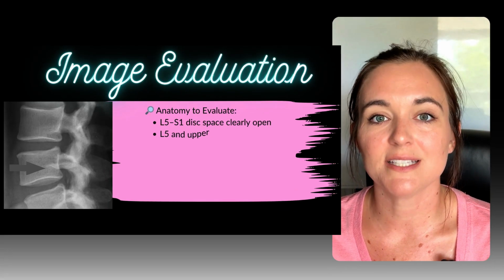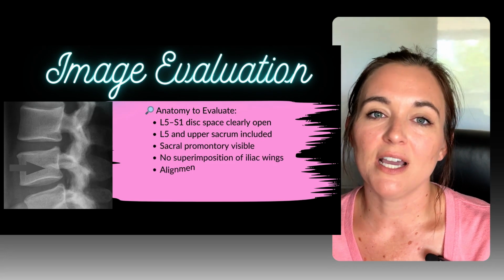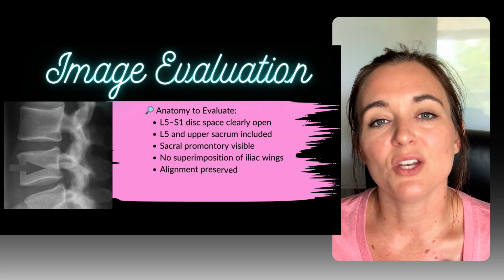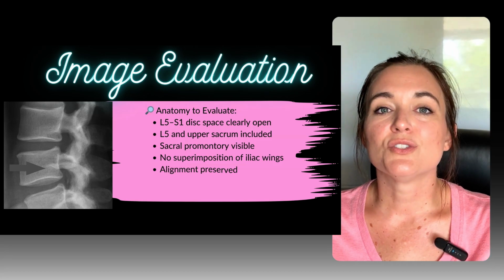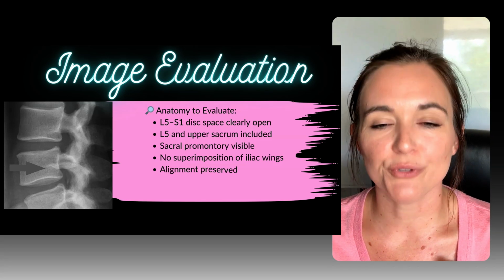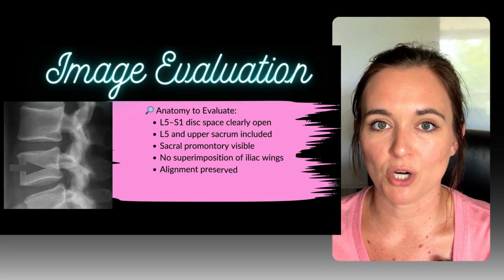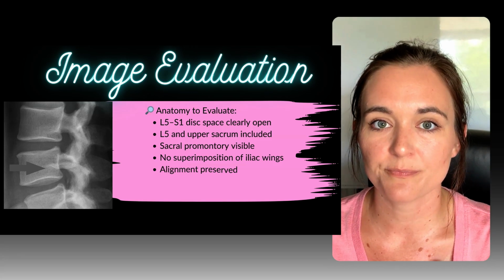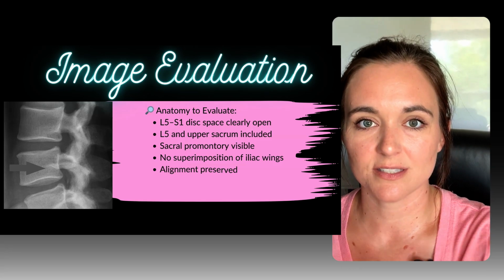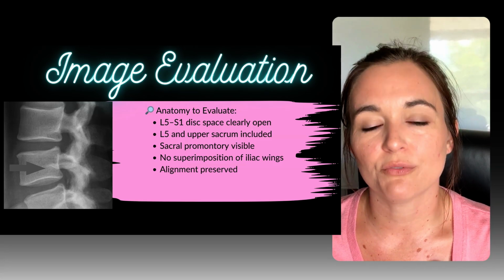This is optional. It's done if you suspect a slip or fracture at the base. Remember, you angle 5 to 8 degrees and center 2 inches posterior to the ASIS and 1.5 inches below the crest. This zooms in on the lumbosacral junction where L5 meets S1. What are you looking for? The L5-S1 disc space, S1's anterior margin to check for listhesis or slippage, and the sacral promontory. This view helps diagnose spondylolisthesis, compression fractures, and posterior element injuries, which are all board-relevant terms.